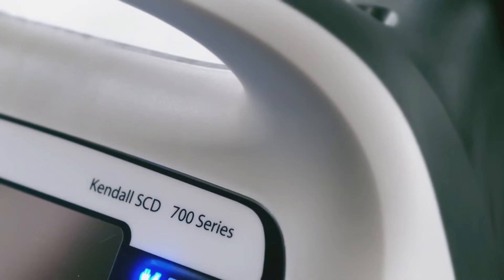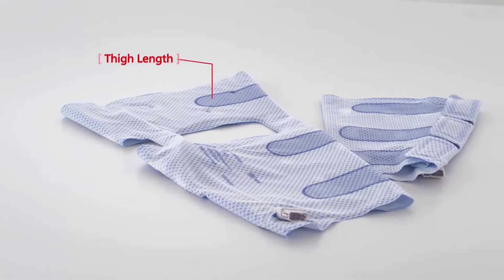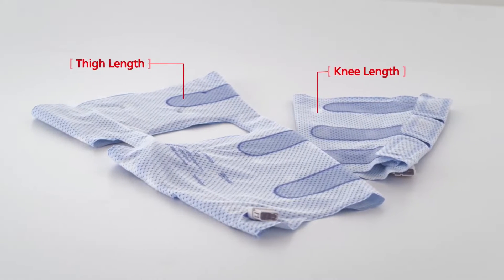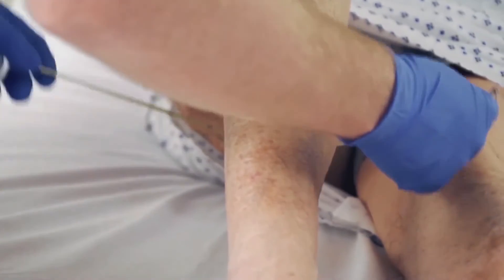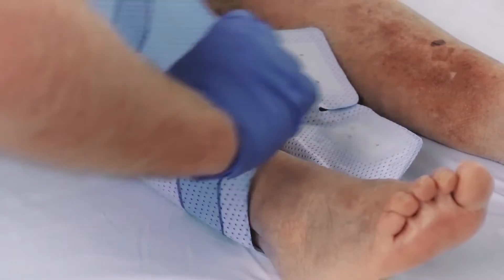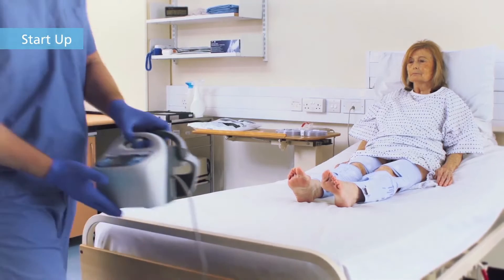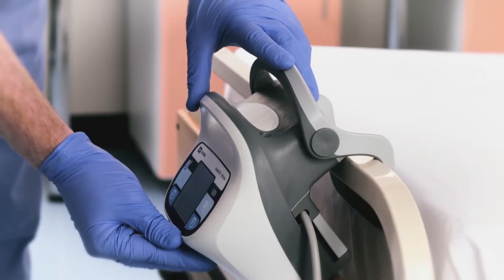What is a sequential compression device? Intermittent pneumatic compression, or IPC, devices are inflatable sleeves that prevent blood clots. You wear them on your calves, your lower legs, to help your blood circulate. A plastic sleeve slides over and past each foot, then goes around each calf and plugs into a small machine that makes it inflate. Another name for an intermittent pneumatic compression device is a sequential compression device, SCD, or an SCD boot.